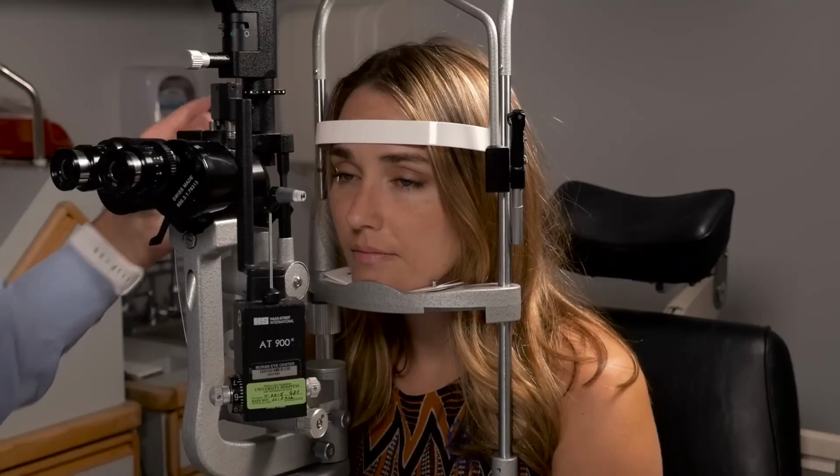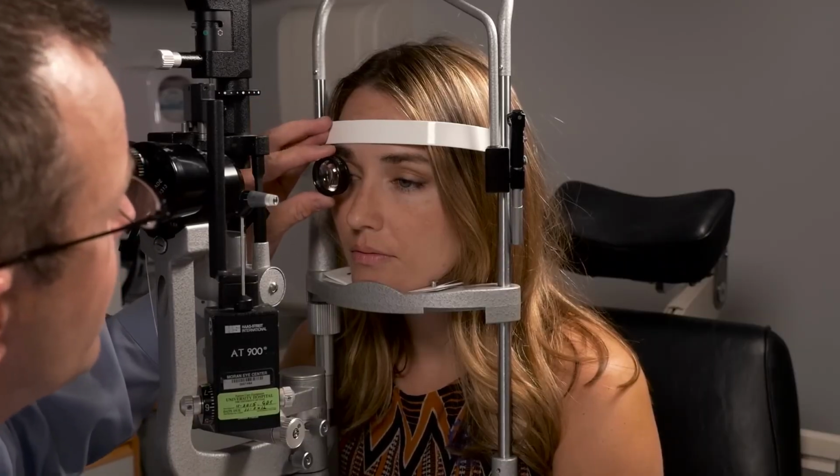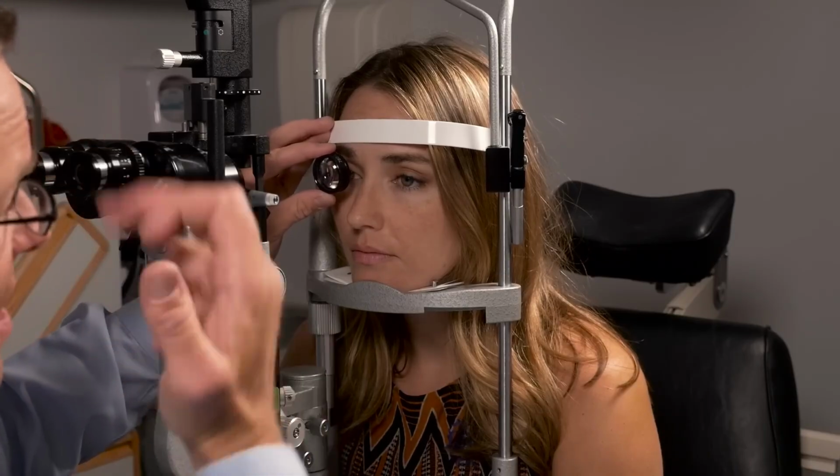As a general rule, you're going to hold the lens with two fingers, your pointer finger and your thumb, and then you're going to use your pinky and a lot of times your ring finger either resting on the patient's forehead or on the forehead rest itself, the plastic forehead rest. And then the trick of how to do this is you're going to put it up in front of their eye without touching it, but just in front of where their eyebrow is.